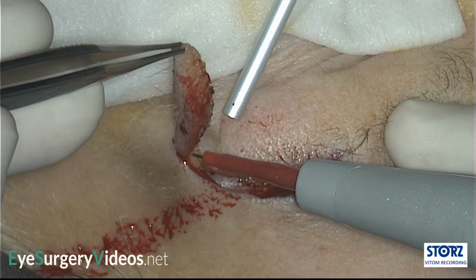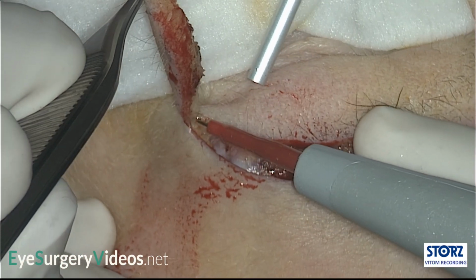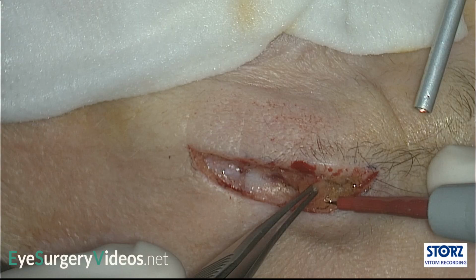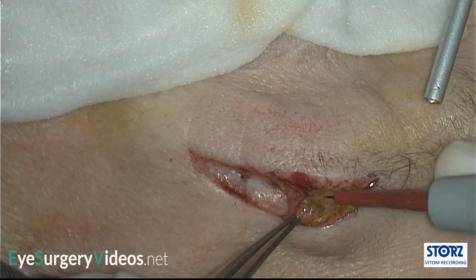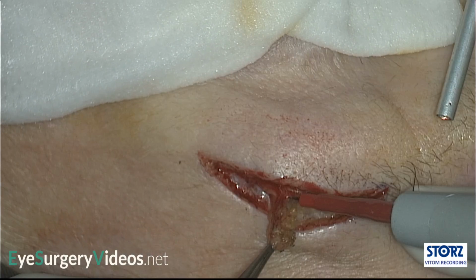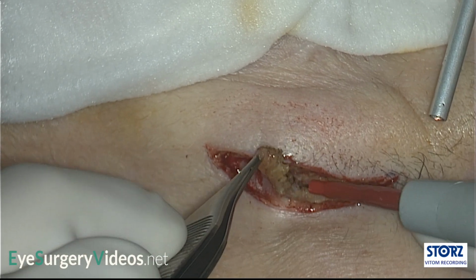Common practice is to excise skin and subcutaneous tissue to expose frontalis laterally and centrally, although medially staying within subcutaneous tissue to protect the neurovascular bundle. If the brow ptosis is paralytic, then frontalis may also be excised laterally to expose periosteum. Having said this, there is little evidence on outcomes with different depths of excision.